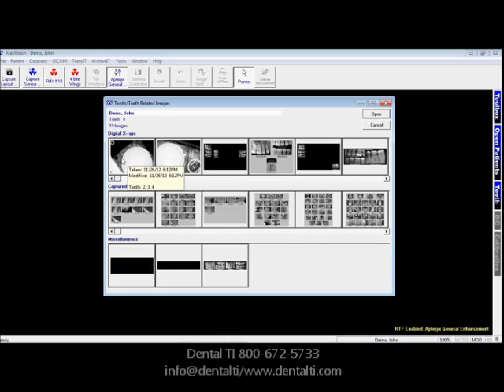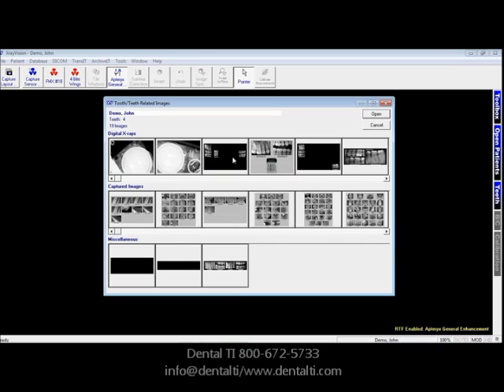These individual images have tooth numbers 2, 3, and 4, so 4 is part of that. And these layouts actually have bite wings in here that have 4 as an annotation as well.